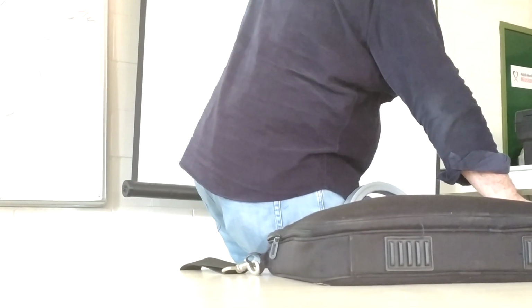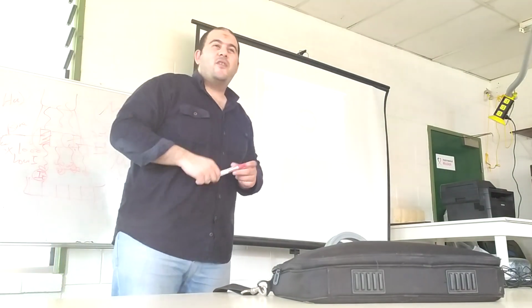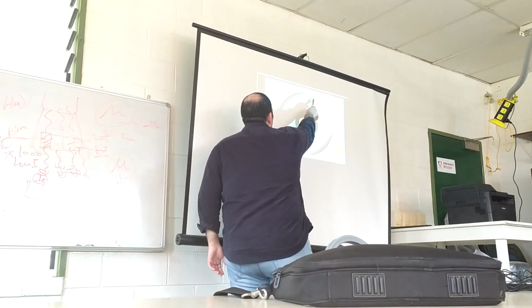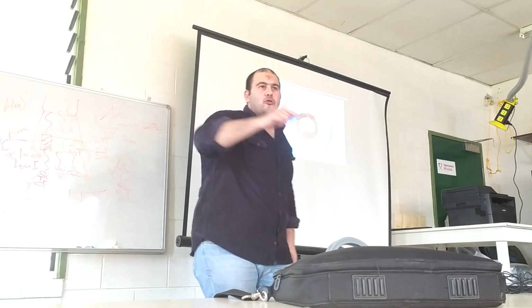Here we are talking about the physics, but it's not important for us, but we have to know that we have different CT generations. The first CT image took 5 minutes to produce. You can imagine? First slice, not the whole scan, in 5 minutes. Because in the past, using first generation, we had only an X-ray tube, a thin beam of X-ray, and only one detector, not a row.